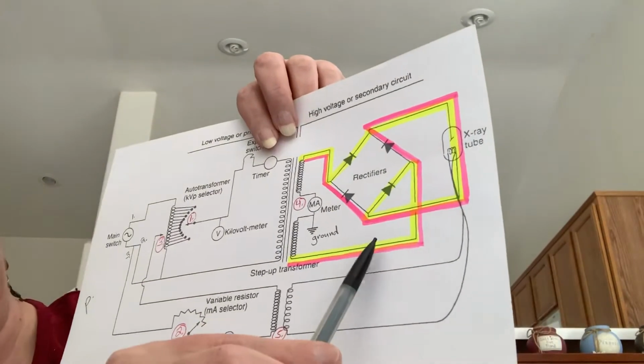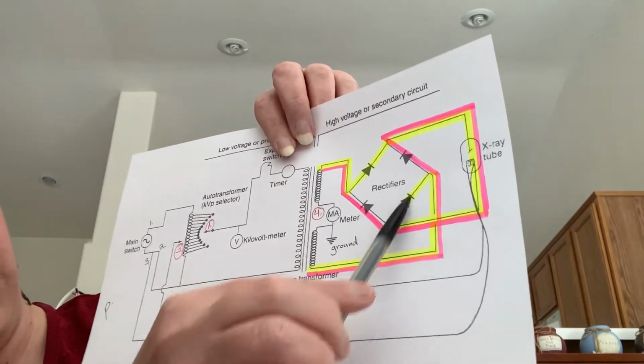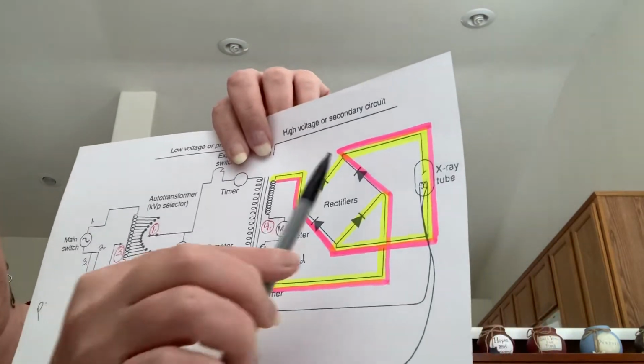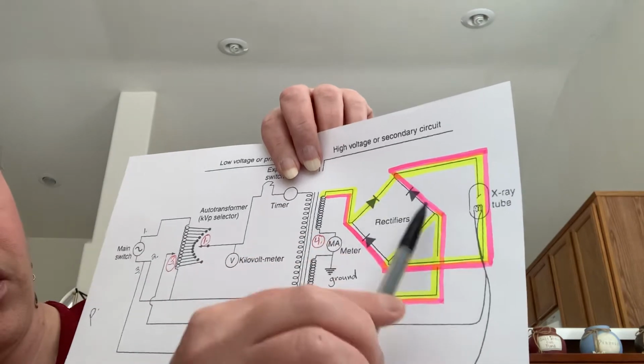And also, each path, there's a point where it's parallel to itself. Like if we look at the yellow part, right here and here, it's parallel to itself. And then the pink, here and here, it runs parallel to itself. Now, after the rectifier, the electricity can finally get to the X-ray tube, and it travels into the X-ray tube.